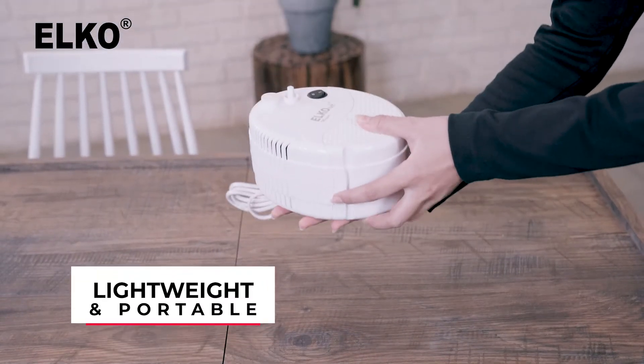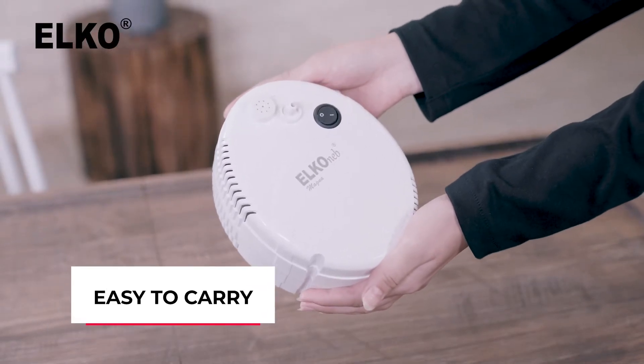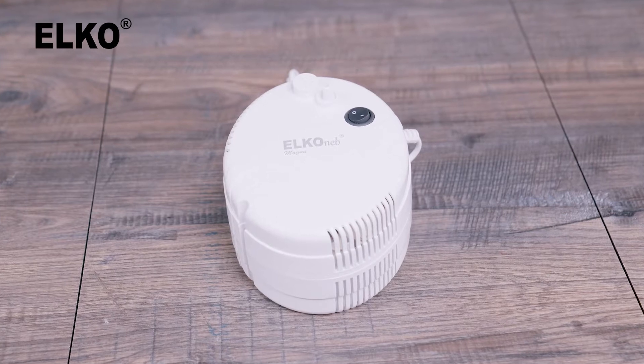It is lightweight, compact, and comes with an innovative design, making it super easy to get and carry anywhere. It has nine basic components.